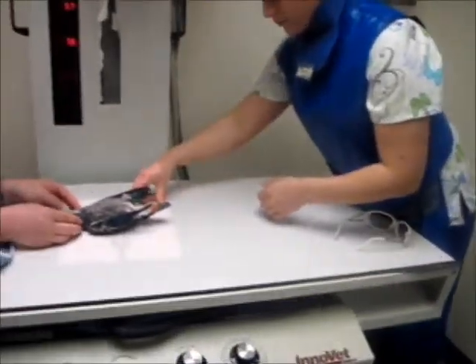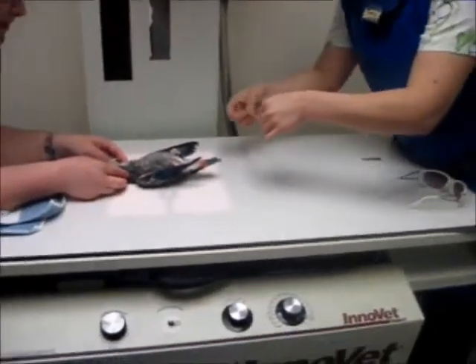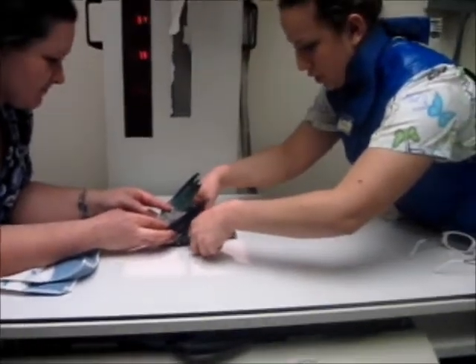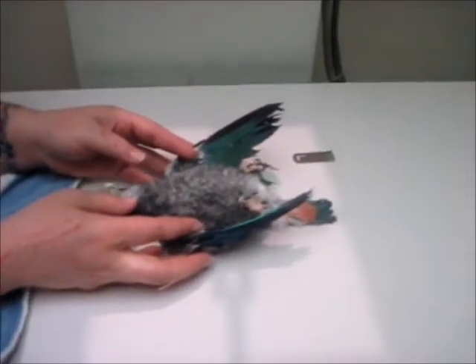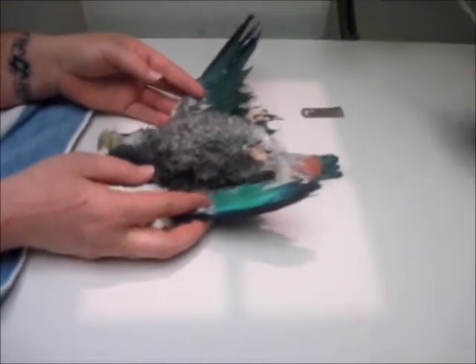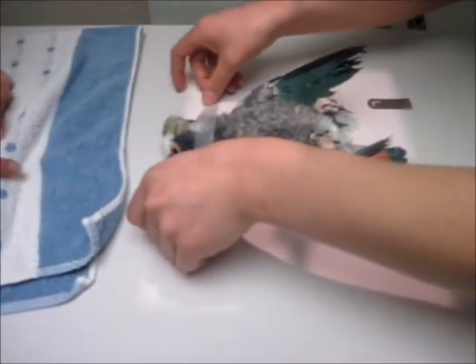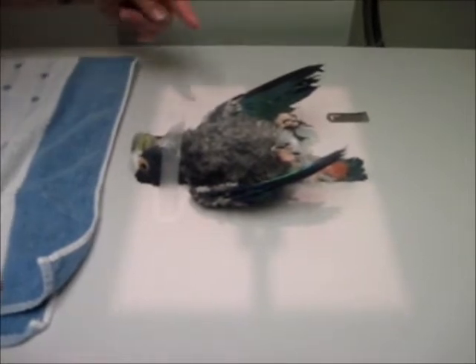Today I am using tape to restrain this bird since it is sedated. First you want to tape down the tail — keep that secure. Then you will tape the neck. You want to make sure that you don't tape it too tight so the bird doesn't choke or suffocate, so you are not cutting off its airways.